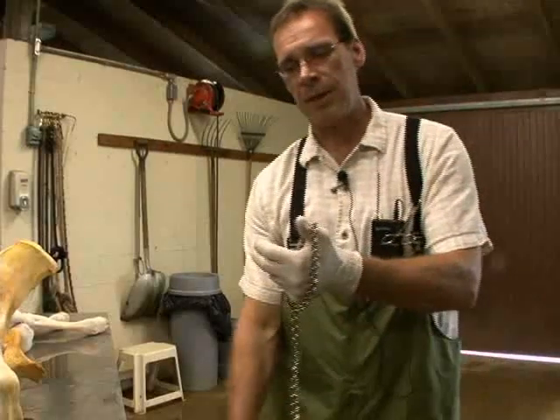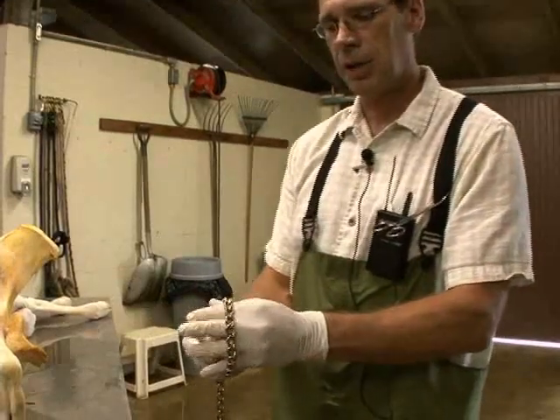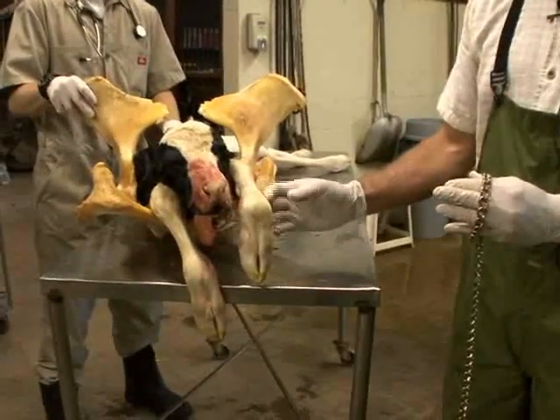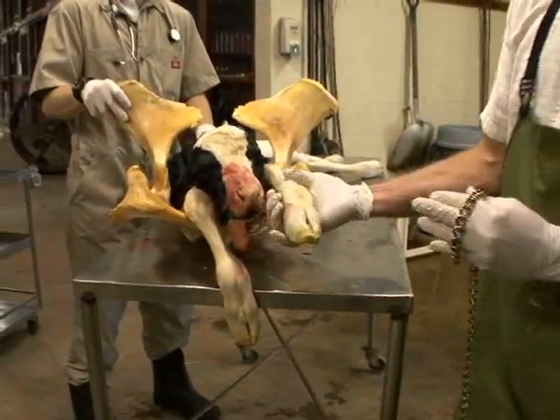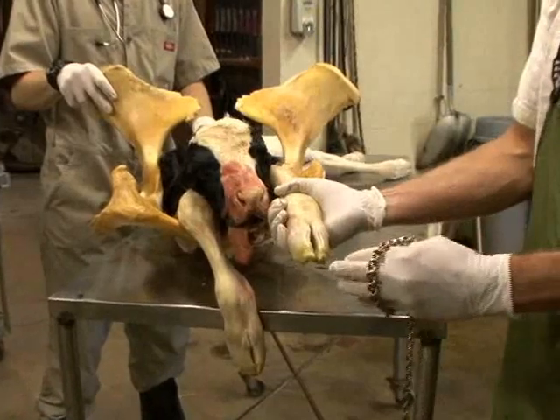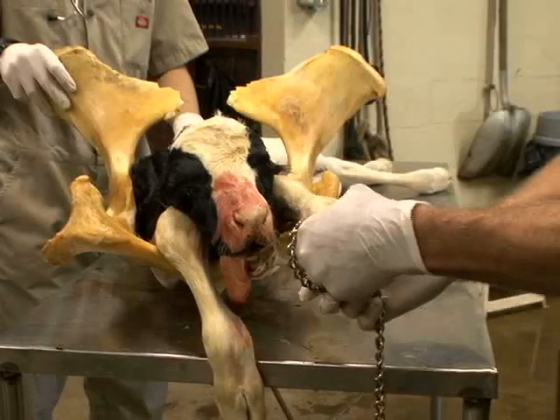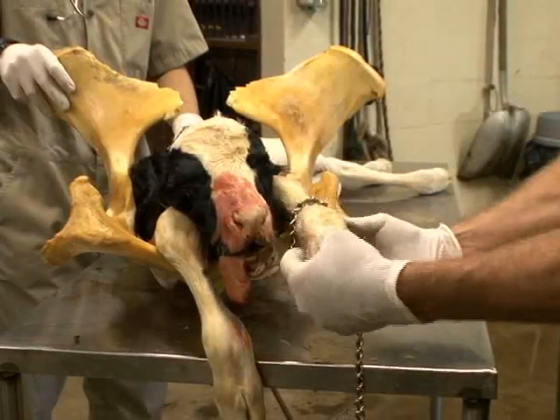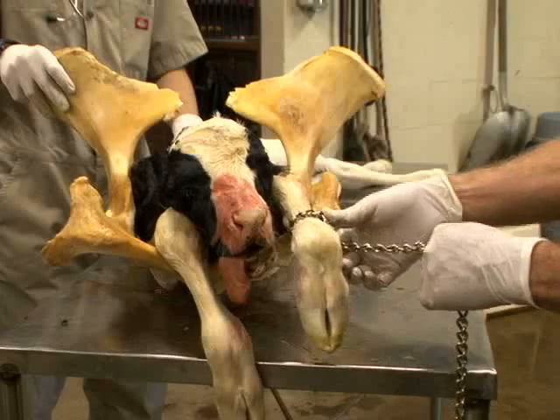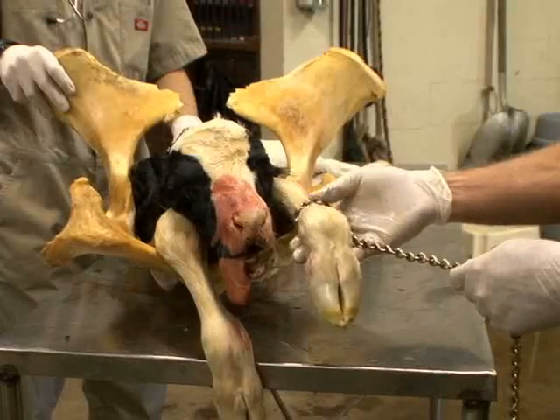The most important thing about placing the OB chain is that the first initial loop must be placed right at the mid-metacarpal area of the calf. So the first thing you'll do is hang on to the calf's leg once you have it exposed out of the vulva lips of the cow, then place the chain over the foot and the claw of the foot, and slide the chain off your hand onto the metacarpal area. Then gently cinch down on the chain to tighten it against the metacarpal area.